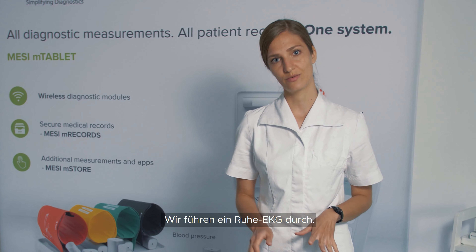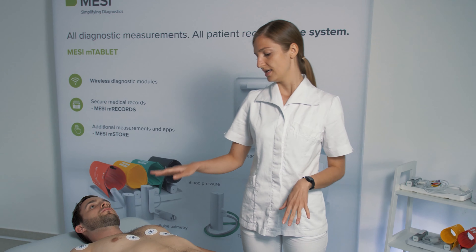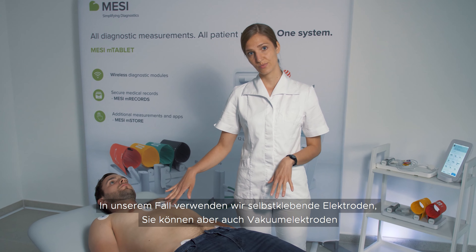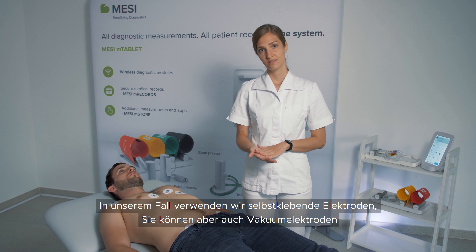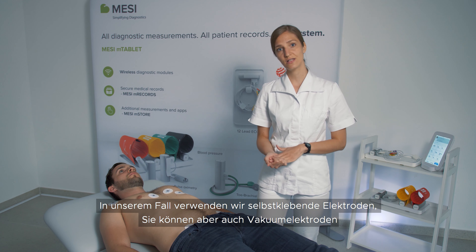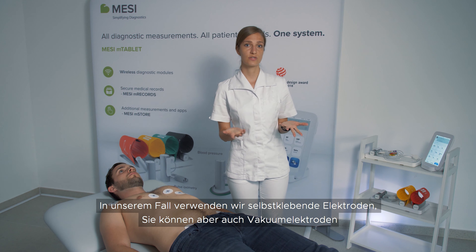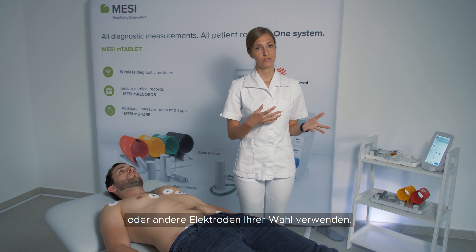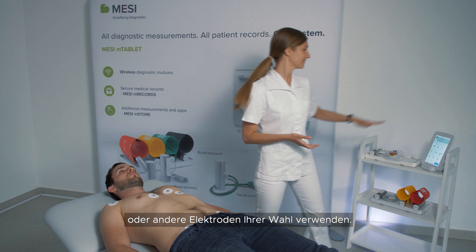We will perform a resting ECG measurement. In our case, we'll be using the stick-on self-adhesive electrodes, but you can also use vacuum electrodes or other electrodes of your liking.